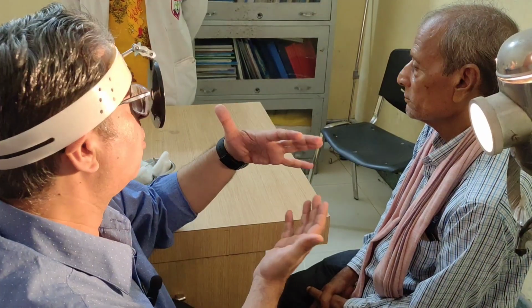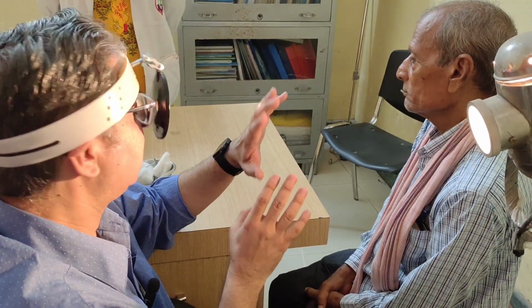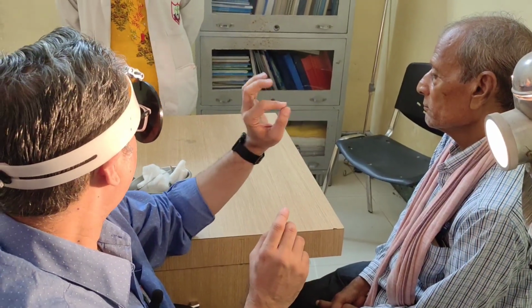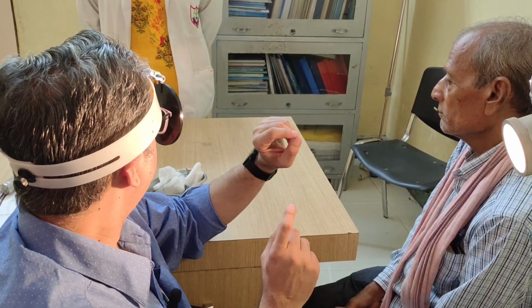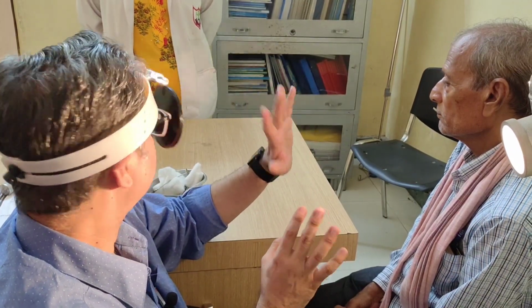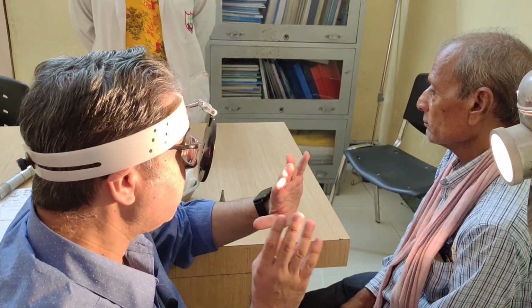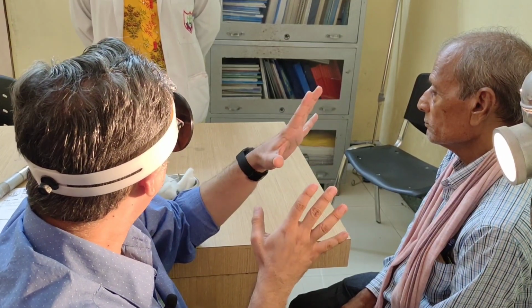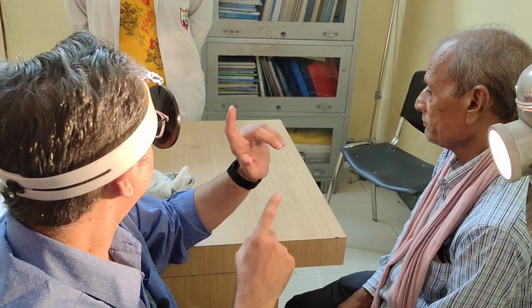Then you have to talk about the other parts of the tympanic membrane, that is the cone of light, whether it is intact or not. In fact, cone of light is the first sign that appears on the tympanic membrane. In an abnormal tympanic membrane, that is the first thing that gets distorted or absent. So that has to be very clear, that the cone of light is present or it is absent. You have to mention that. And cone of light is commonly present in the antero-inferior quadrant.